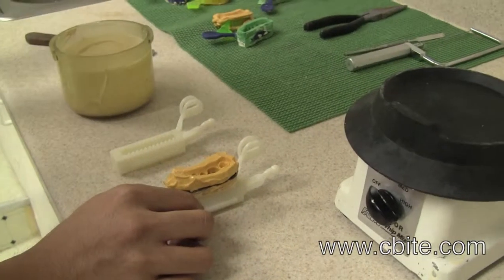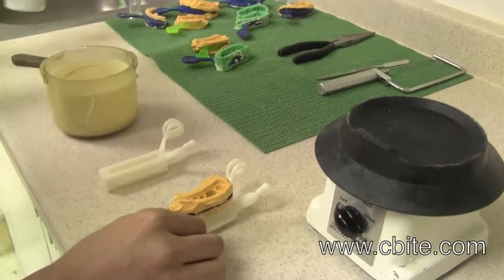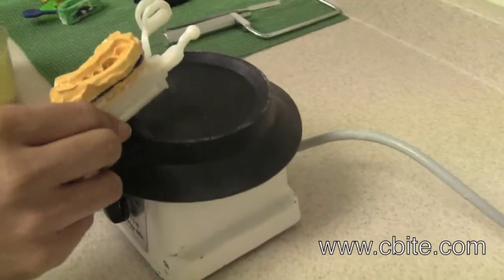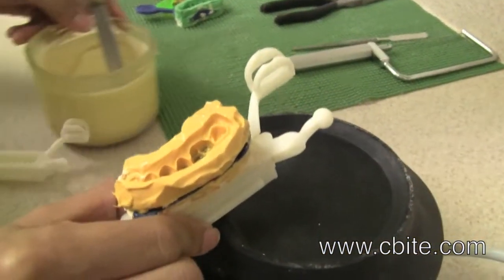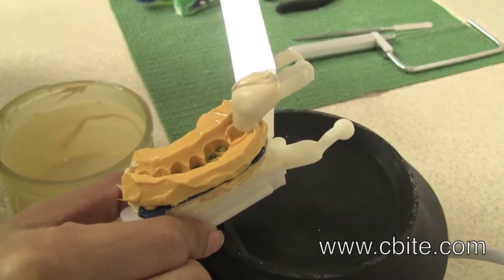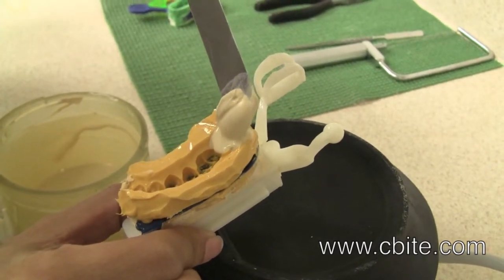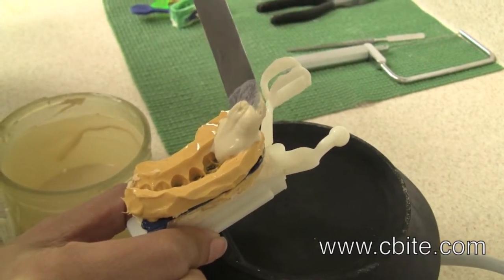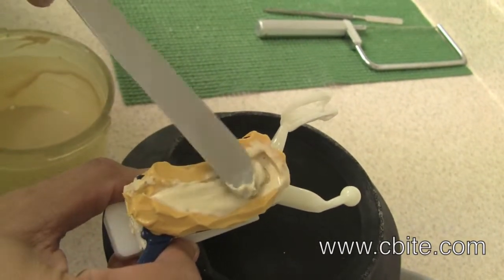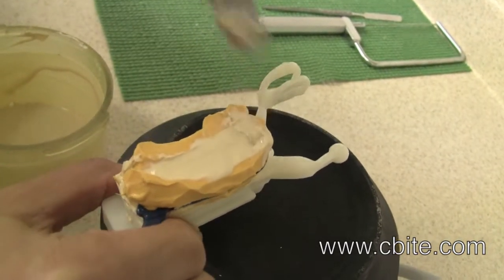Now we are going to be doing the opposing side. Applying a little debubbleizer here.